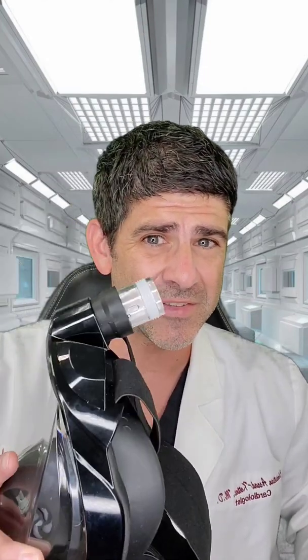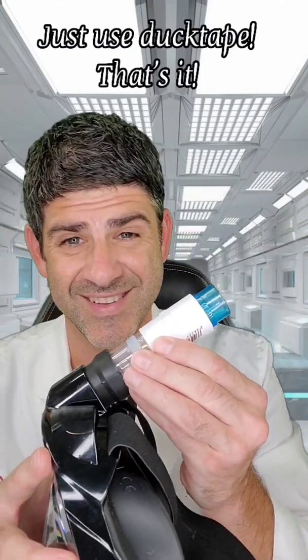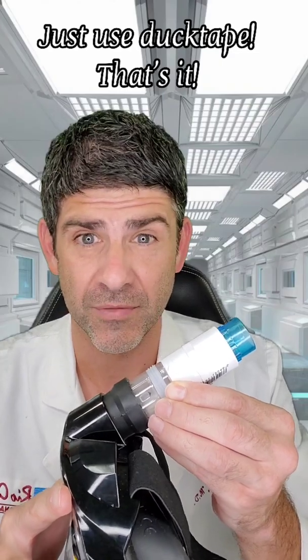The third option just involves the mask, this three-fourths PVC filter, and an attachment for the viral bacterial filter — plus duct tape. And it works perfectly fine.